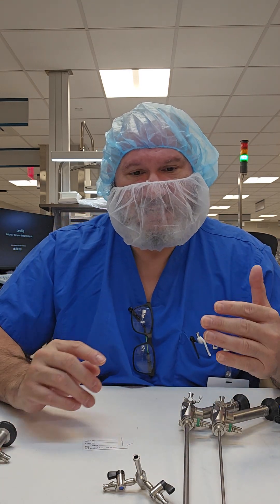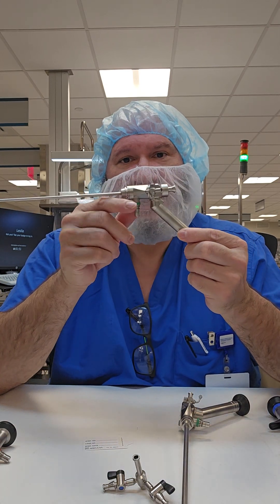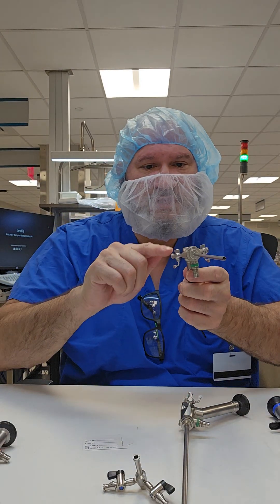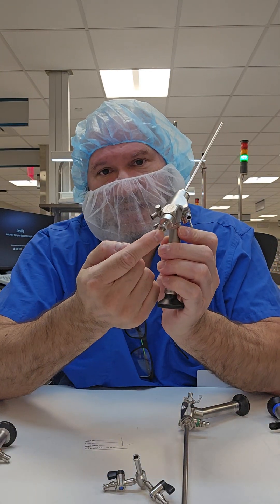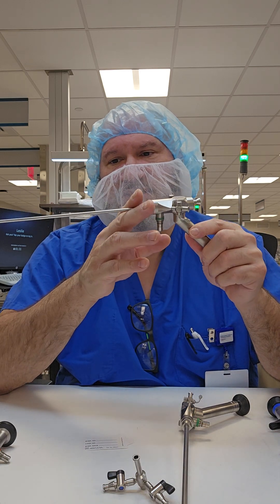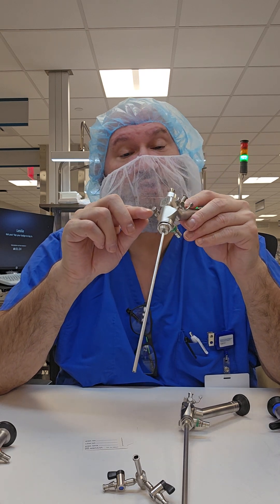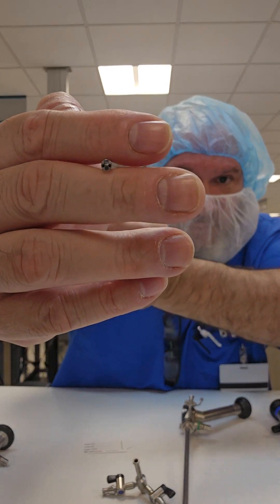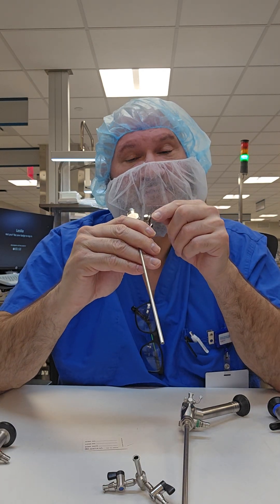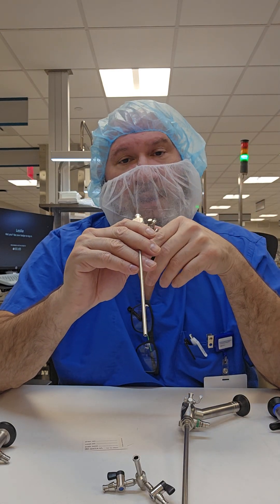Scopes come in different diameters, lengths, and designs. This is also a rigid scope but it is an angled, operative scope. How do I know it's operative? There's a channel in there, two flush ports to flush and suction, and an instrument channel that allows a device to pass through and perform procedures. For inspection, because this scope has a channel, you want to flush it or use a borescope of the proper size. You may be able to go down the instrument channel but not the flush ports, so having appropriate borescope sizes is important.